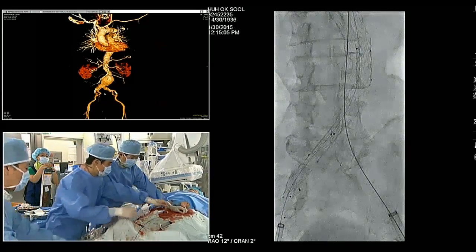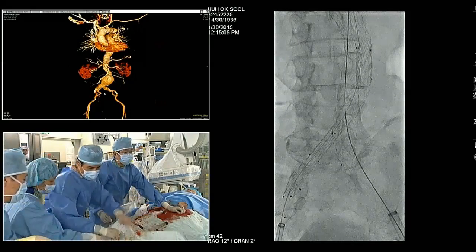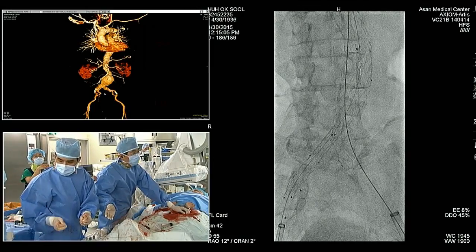About 20 cc is better. So I think we'll take a final image here, then go back to the other room to see how they're finishing up. Okay. So we'll just have a look here at their final injections, and then we'll switch back over.